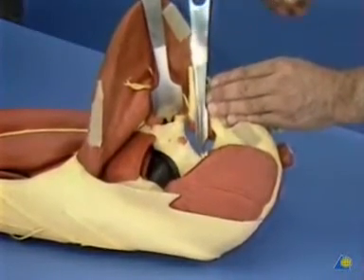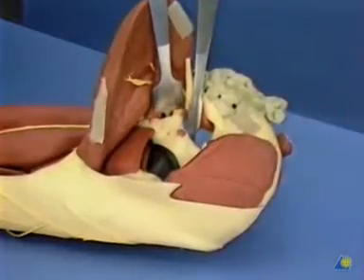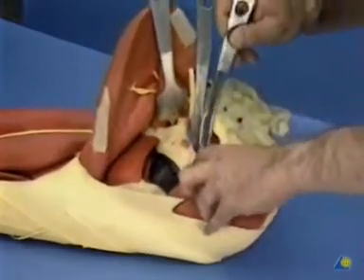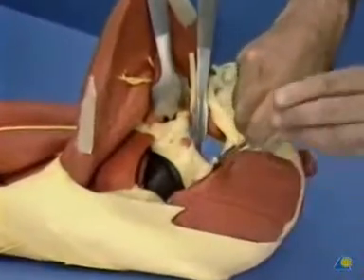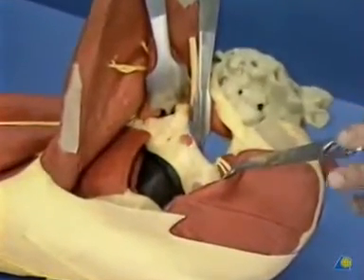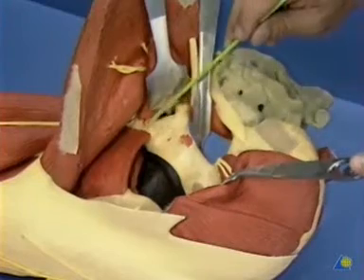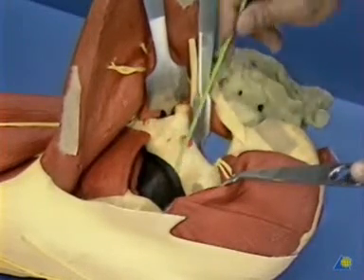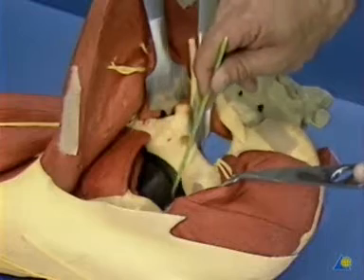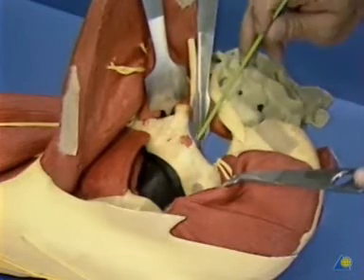Another retractor can also be used in the greater notch in front of the piriformis muscle. And often, another retractor with the tip driven into the iliac wing to retract the abductor muscles. This now provides exposure of the retroacetabular surface from the ischial tuberosity to the inferior ilium. The hip capsule is seen here, which can be opened for access to the joint.